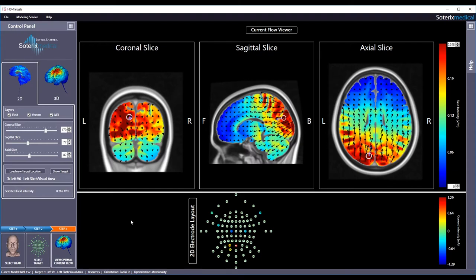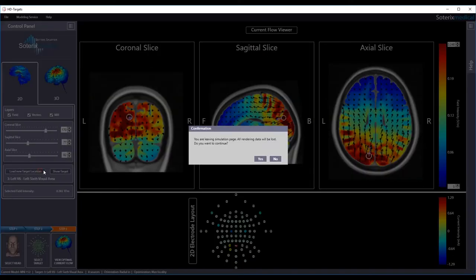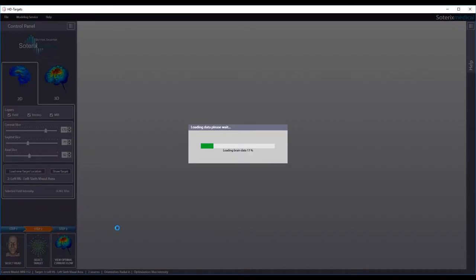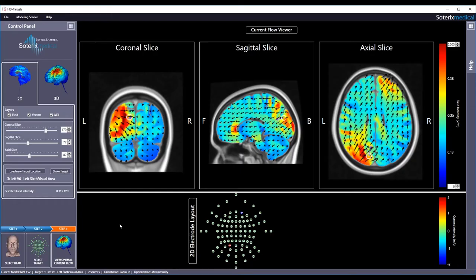To view the prediction for the same target but with max intensity constraints, hit select target, select max intensity constraint and hit step 3, view optimum current flow as before. Note an electric field value of 0.315 volts per meter is induced at the desired target.